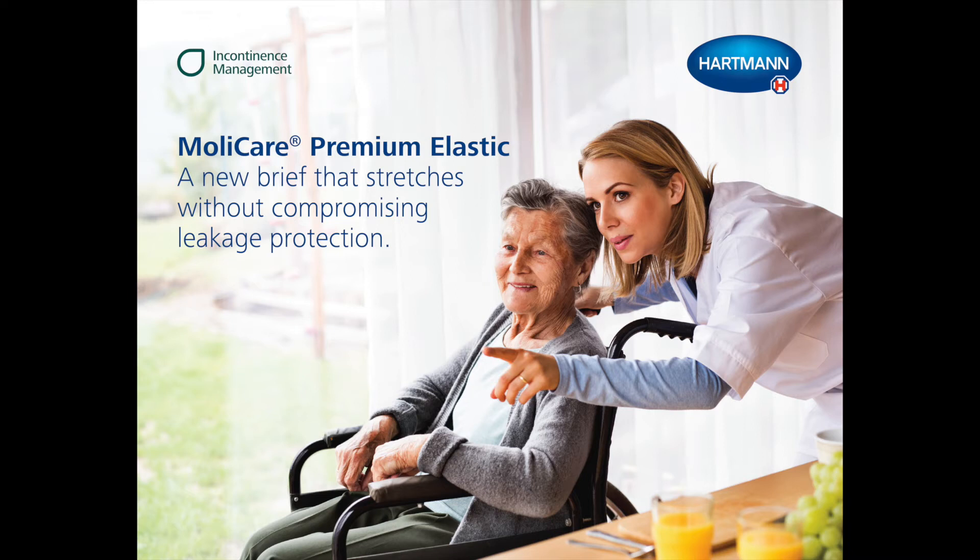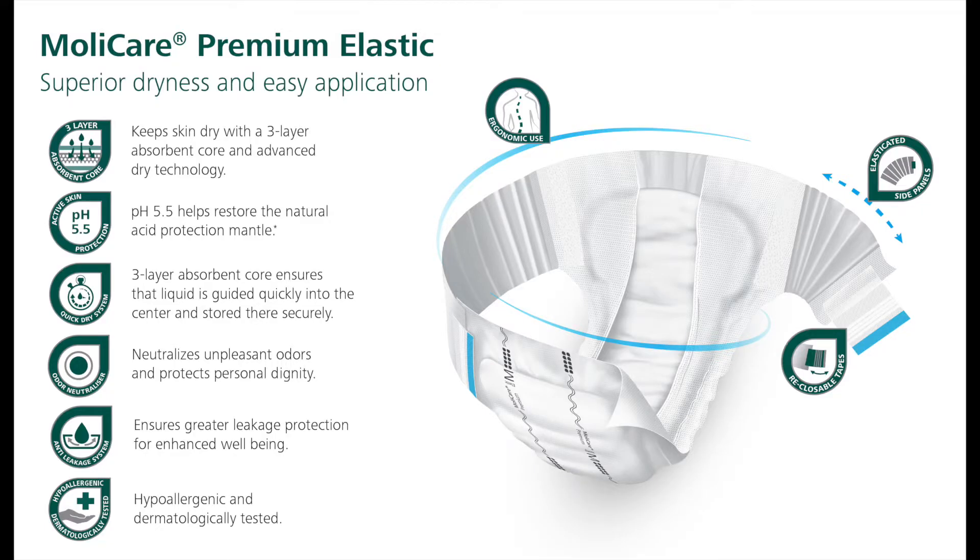MollyCare Premium Elastic is a new brief with patented elasticated side panels and premium leakage protection. The brief stretches, accommodating all body shapes and moving along with physical activities. Each side panel now only has one extra wide hook tab, which allows for quick and easy handling and secure fixation.